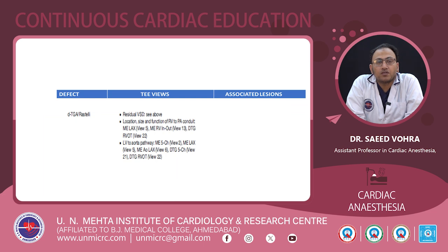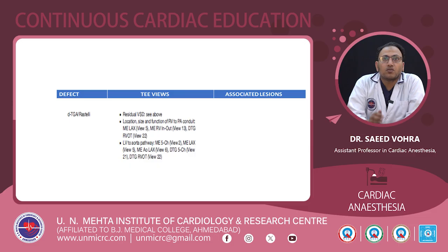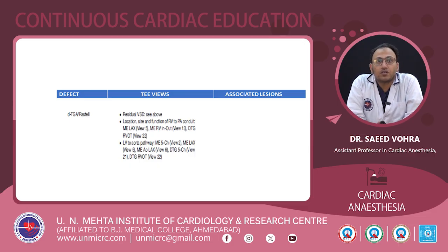For TGA patients with VSD and pulmonary stenosis repaired with a Rastelli procedure, the residual VSD is to be looked for, along with the location, size, and function of the RV to PA conduit. We can use the mid-esophageal long axis view, RV inflow views, and deep transgastric RVOT view. For the LV to aorta pathway, the mid-esophageal five-chamber view and long axis view, along with the deep transgastric five-chamber view and deep transgastric RVOT view, will give you the information.